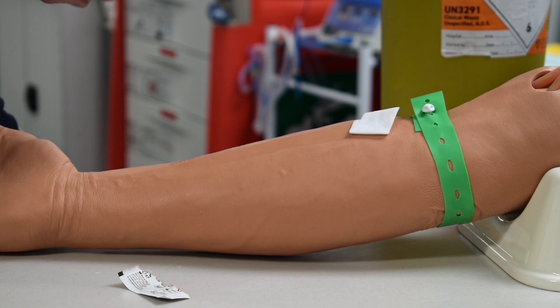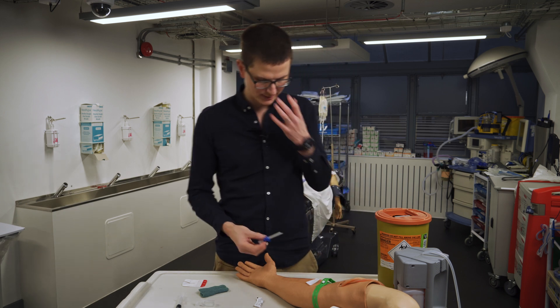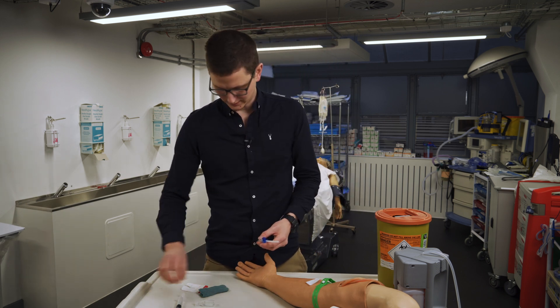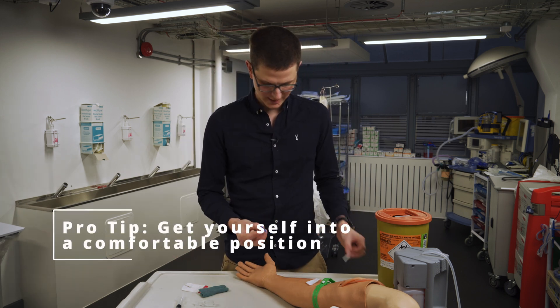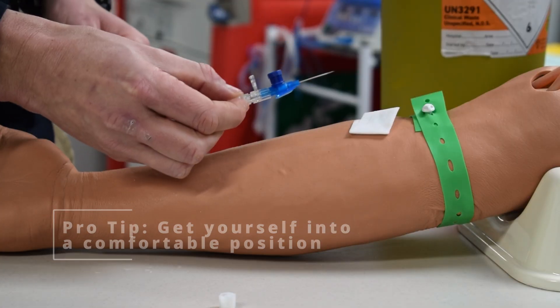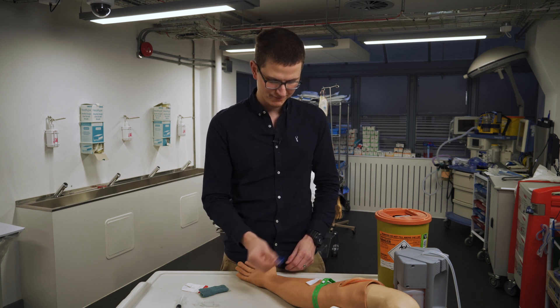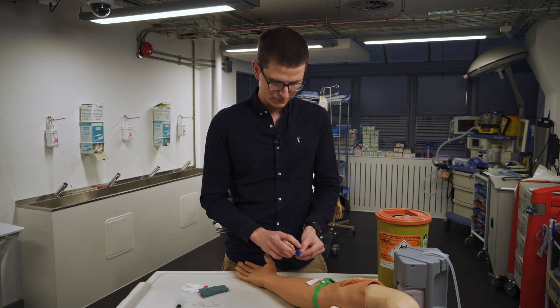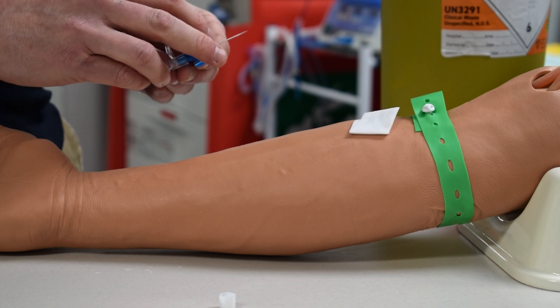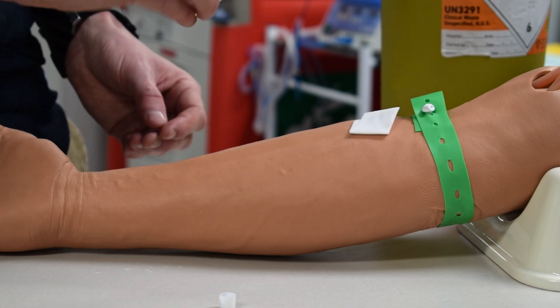We've cleaned the site. We have our IV cannula — I'm using a small one just because it's a plastic mannequin and it makes smaller holes. The trick with this is the more fingers you hold it with, the more control you have. If I'm holding it at the end I have very little control, but with four or nearly five fingers on it you can tell the difference in how much more control you have.